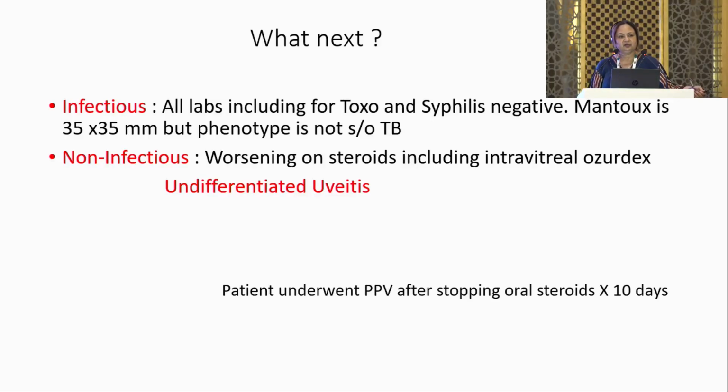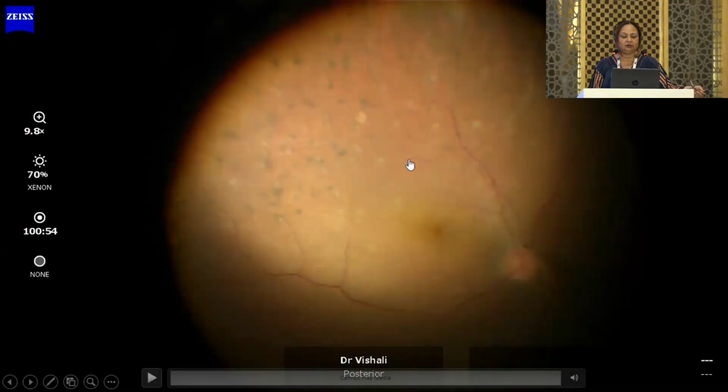So this is the first thing. If things are not right, please go ahead and do the vitrectomy.